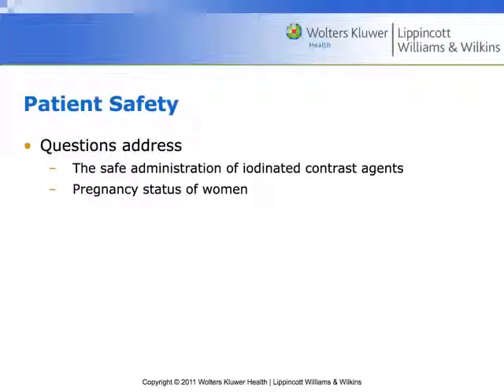I just kinked it off, right? Another thing, with older people, when they bring their arm up really high, they've got bursitis or whatever, I might kink something up here. I was telling some of the students the other day, I had a patient, I was doing a CT of her chest, all the contrast went in really smooth, I come to review the images, there's no contrast in this person's chest, this old lady's chest.